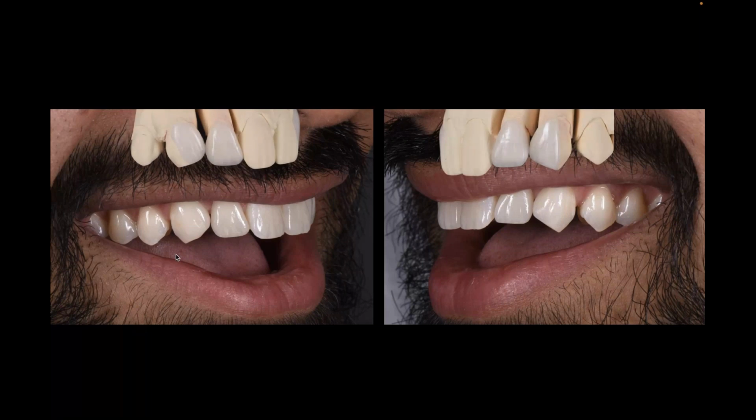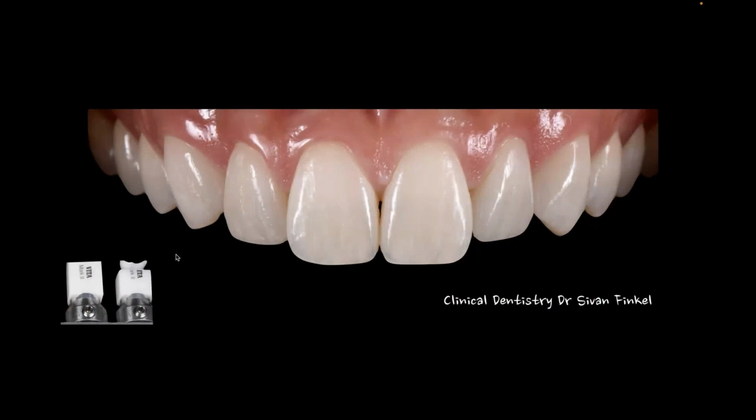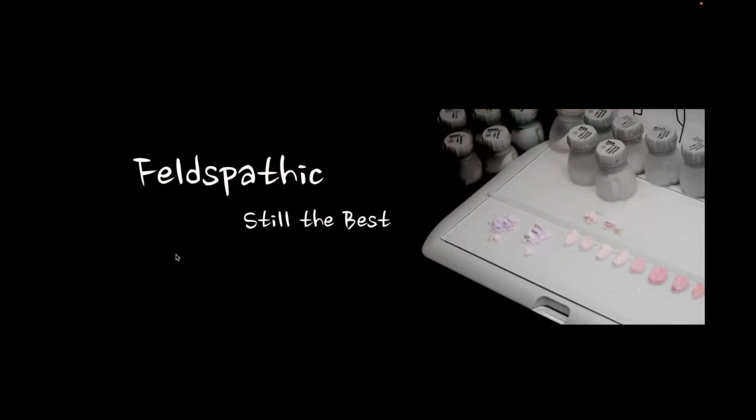So a milled feldspathic veneer, the business model of doing feldspathic veneers again, more than just monolithic materials. Technically it's a monolithic material, but it's a feldspathic monolithic, and some really nice results. For me, this is still one of my favorite materials for micro veneers. But if I have my way, for the majority of my veneer cases, feldspathic is still where I'm at.